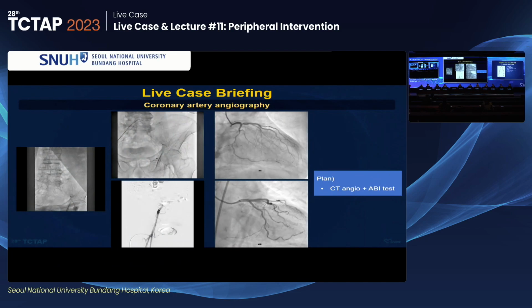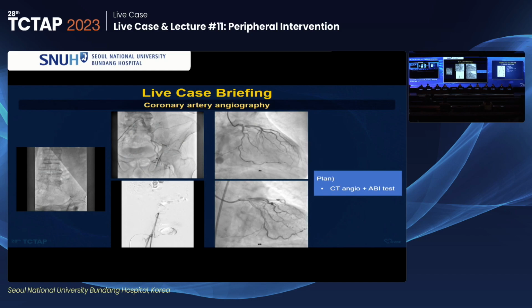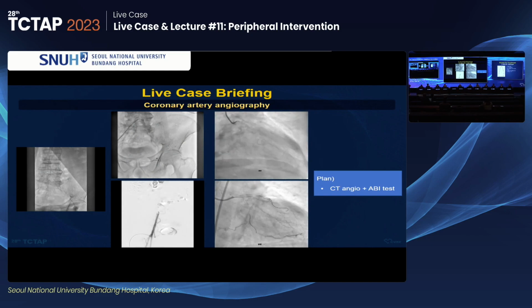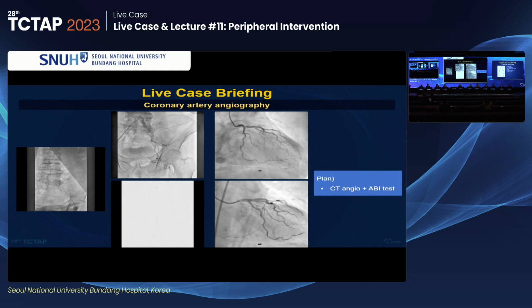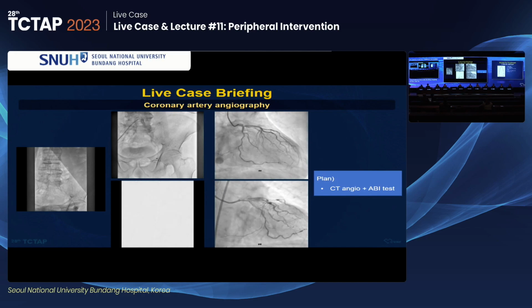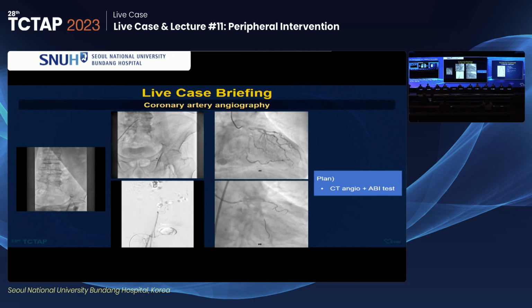So at that time, they did it blind, it means that they felt a pulse somewhere in the left groin. So they did a left femoral puncture, but could not advance the wire. So this time, the elective procedure is for the left claudication.